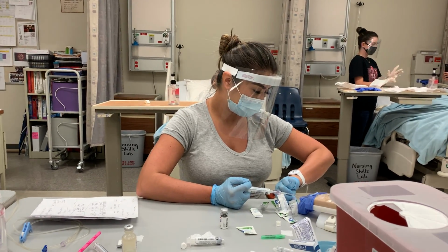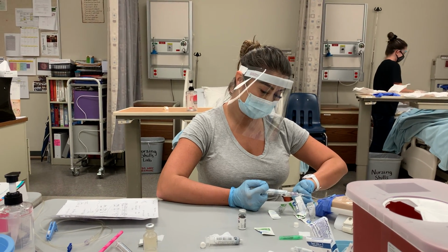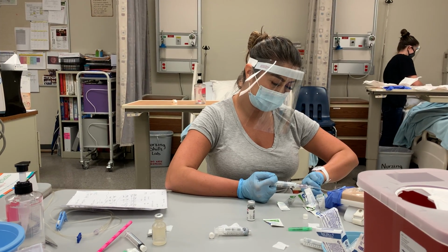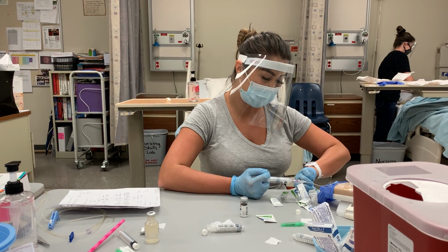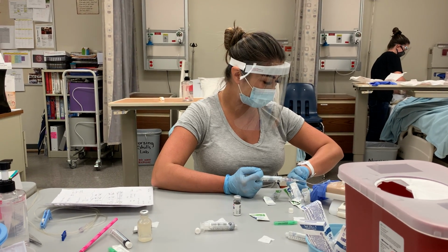So that is ready. Gonna remove the old pad. Still feeling okay? Yes. Okay, good. Hopefully you'll be feeling the pain going away now since the medication is already in your system.